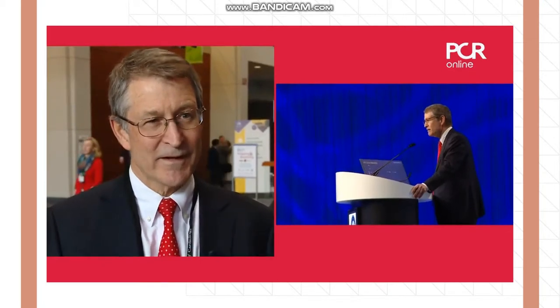There's still more paravalvular leak for TAVR than there is for surgery. There was 5% versus 1%. But remember, 84% of this trial was done with the first generation CoreValve. Only 16% were done with the new Evolut R, which has a lower paravalvular leak rate.